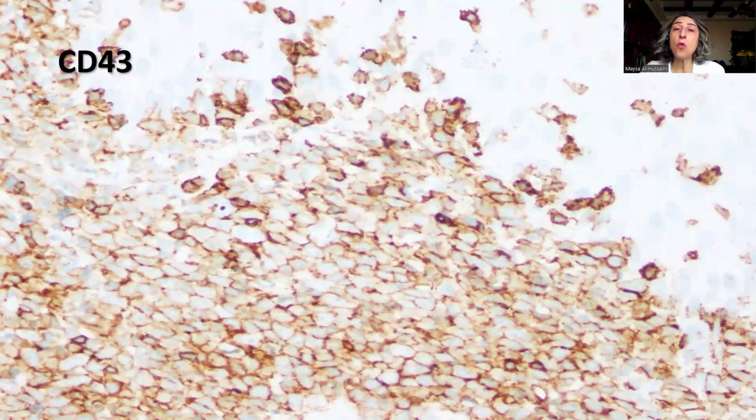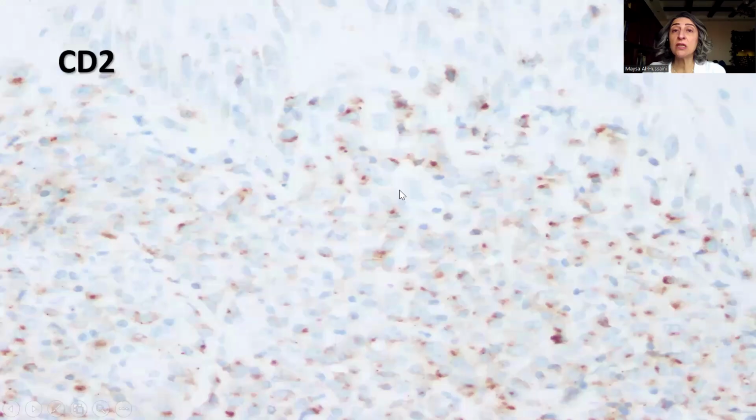What is really important is always to remember to use something like CD43. I like it a lot. It really is a wide-spectrum immunohistochemical marker for hematolymphoid proliferations in general. Even the cases that are CD45 negative can still be positive with CD43. So always include CD43 in your panel in case you are suspicious of a hematolymphoid infiltrate, because of the wide coverage of antigenicity with CD43.